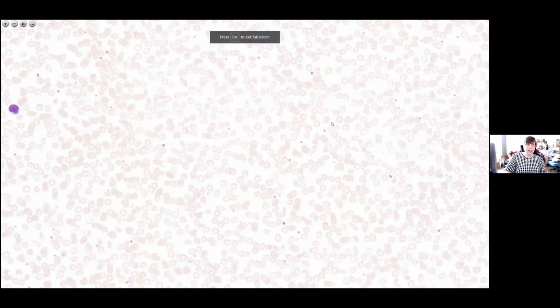Sure. So I will say, upon looking at this film, apologies for the quality of this film, it is something that we run into in the laboratory. Sometimes you don't get the best smear, and sometimes if the film's too old, you might not be able to remake it, and you have to make do with what you've got. Now, the morphology on this is accessible, but it is somewhat a thick area of the film that we have to work with. So apologies for that when we start.